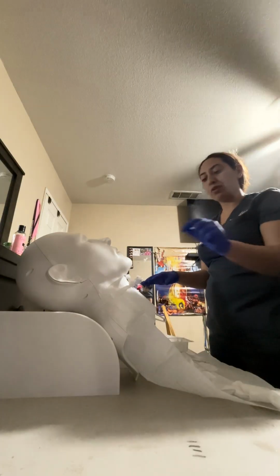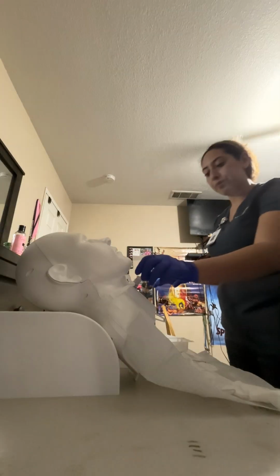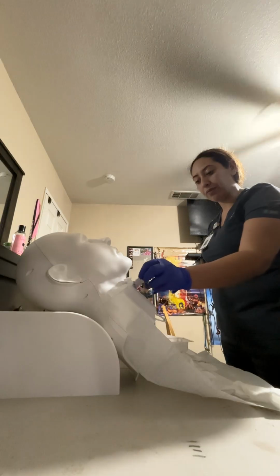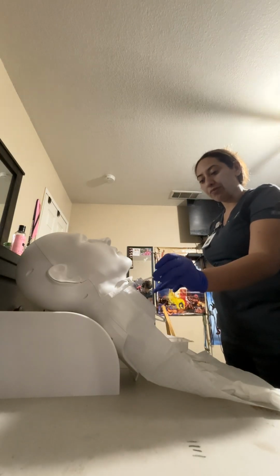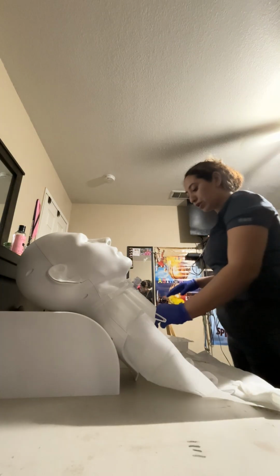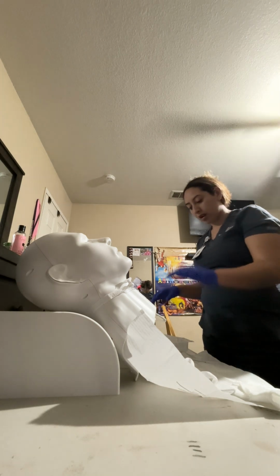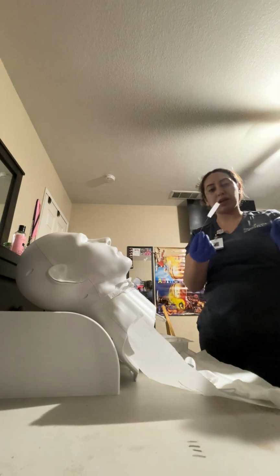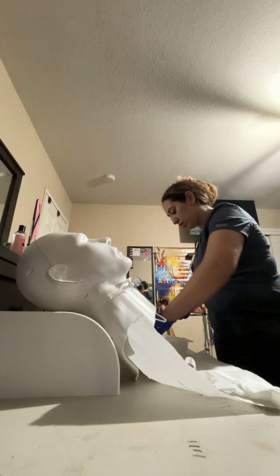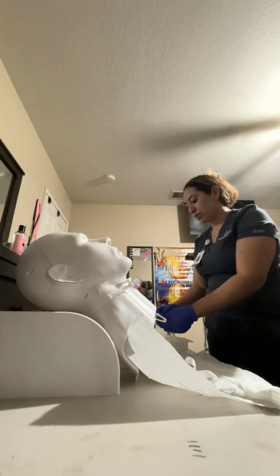Okay, Alfredo, I'm going to remove your inner cannula. I'm going to place it here in the bin and soak it. So I'm going to twist and unlock my patient's inner cannula. So after removing it, I'm going to place it in the soaking bin. I'm going to allow that to soak over some time. I am then going to use my brush to scrub the inner cannula. So in the solution, I will scrub it. We'll clean it.